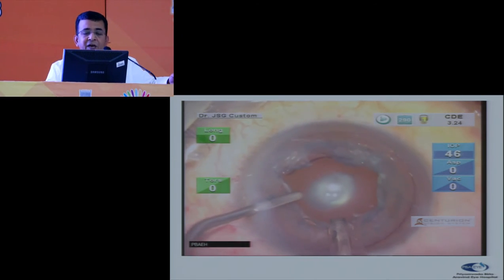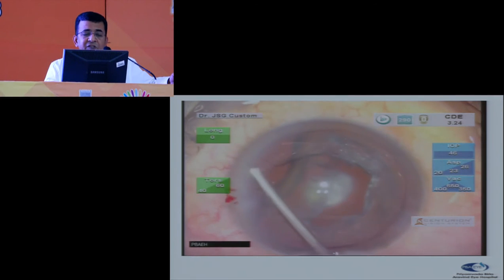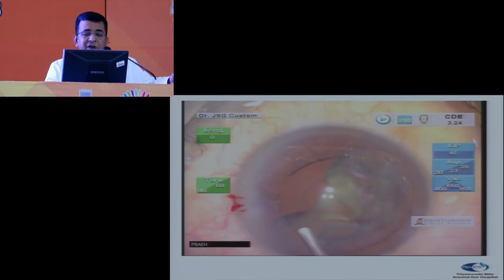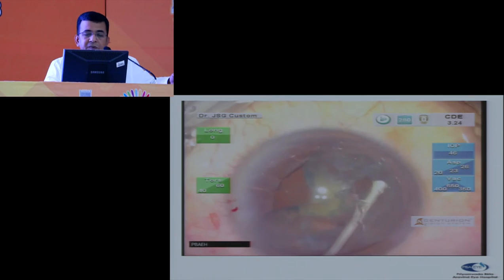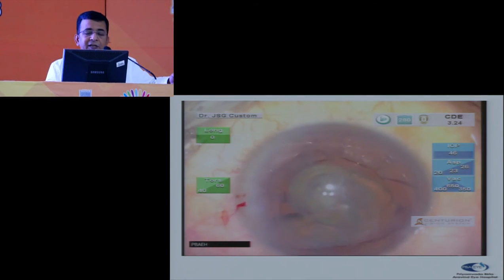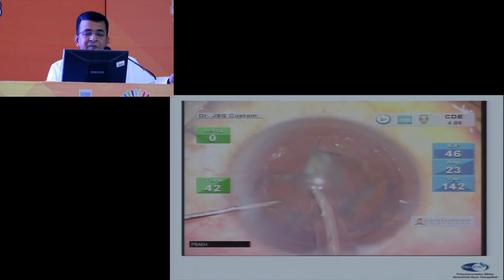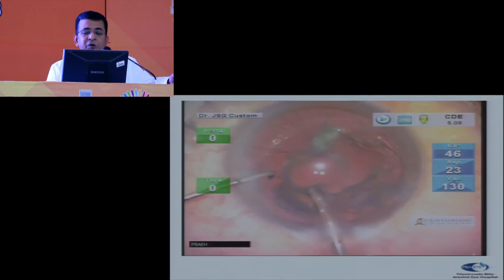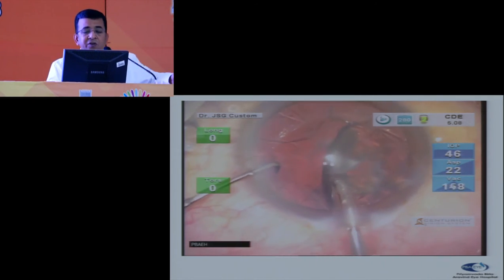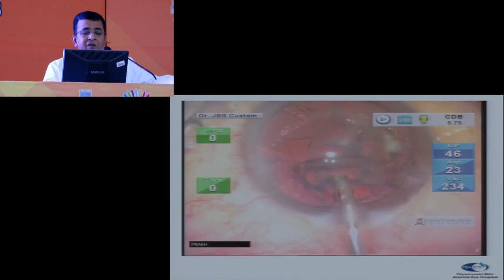And as we see, we could peel off the cases and we replenish the chamber with the visco. We do some visco dissection of the epinucleus from all the sides, because this probably helps reduce the chamber, maintain the chamber stability. And then as I peel off the epinuclear plate, I see there is a rent underneath. So this is the advantage of a lower setting, a control setting, where I am able to grab hold, I am able to aspirate, I am able to do everything without chattering, without a fluctuation of the anterior chamber.